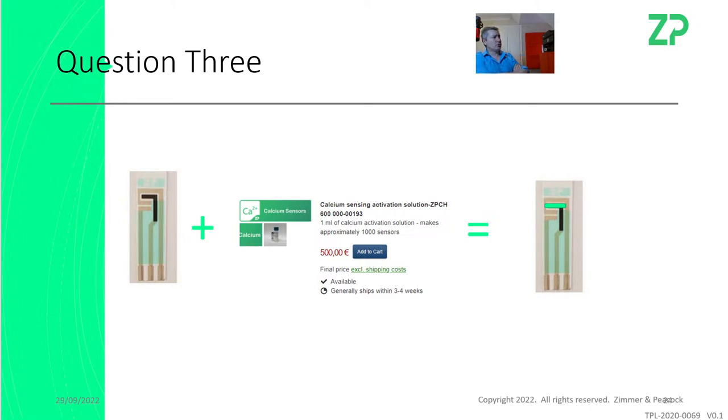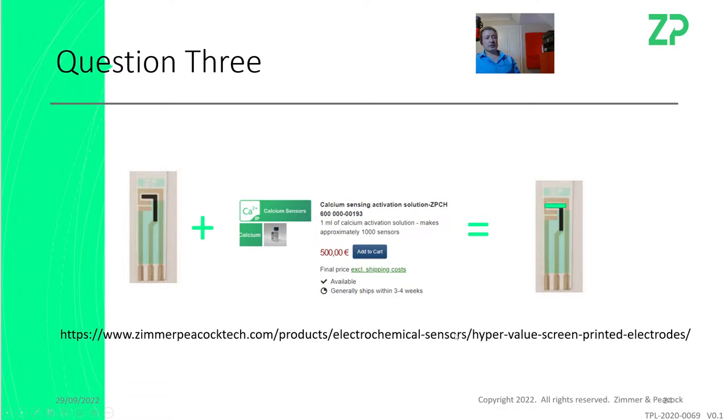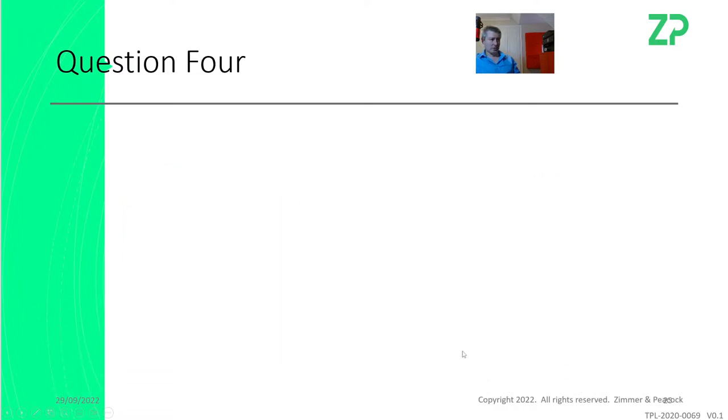procedure. And we were doing this work recently in some of our workshops. And actually, I think within about 15 minutes, we were ready to actually test the electrodes. So it can be a fairly quick procedure. And obviously the hypervalue electrodes, I've got a link to it there as well.